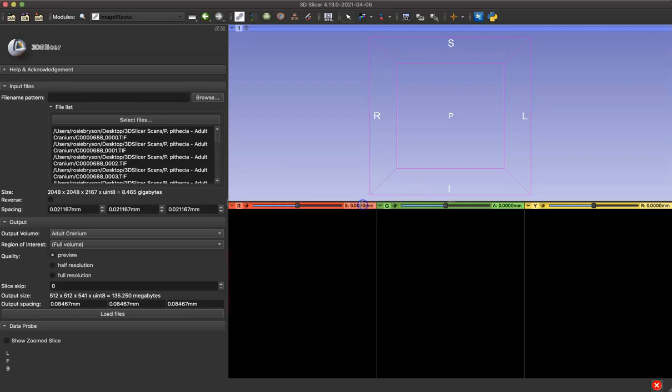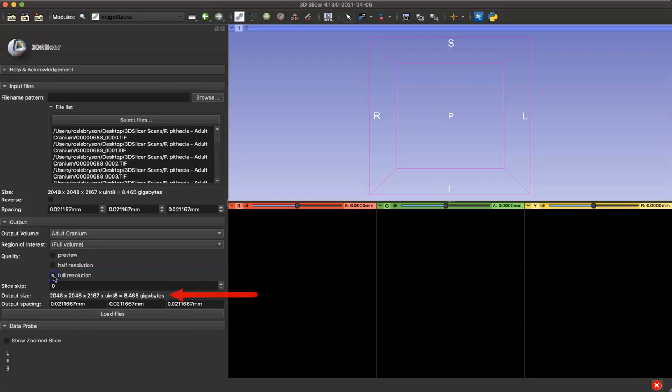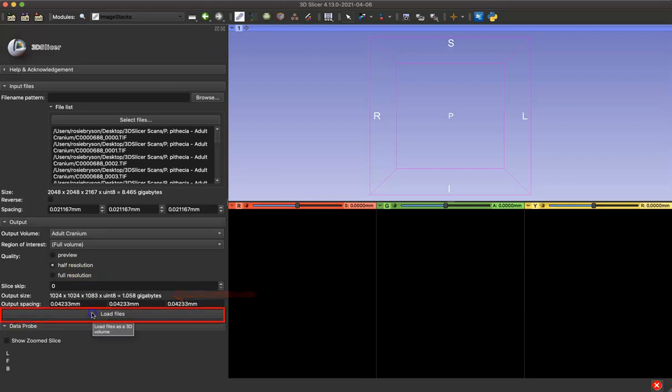And you can choose the resolution size that you want to load the data in. You can use Preview, Half Resolution, or Full Resolution. You can see how the volume size changes as I adjust that resolution. For example, I'll use Half Resolution and then we can click Load.